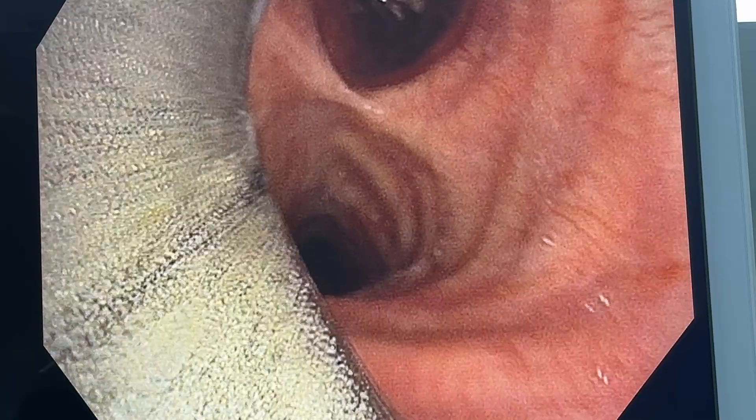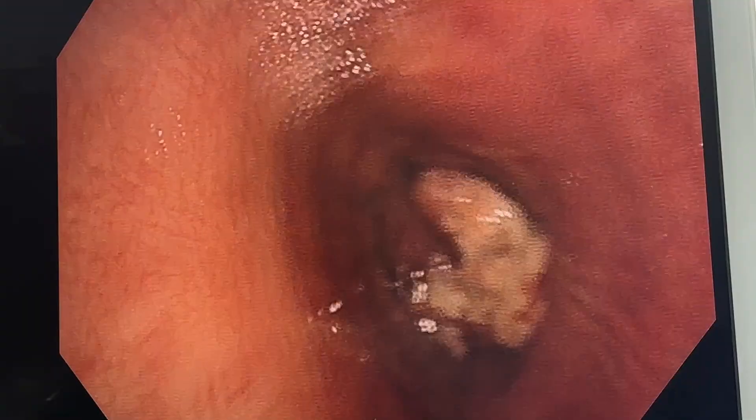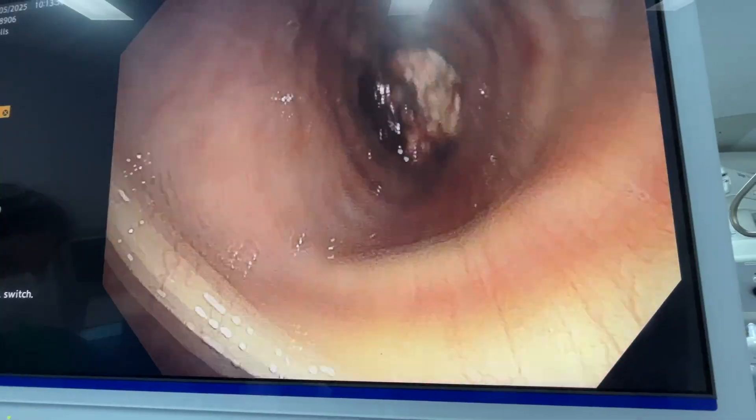Hi, it's Barton here. In this video I'm going to show you how I use the cryoprobe to help to debride an endobronchial tumor through the rigid bronchoscope. I use a therapeutic flexible scope, and you can see at the carina we go to the left main bronchus, where there's an endobronchial tumor completely obstructing the distal left main bronchus.